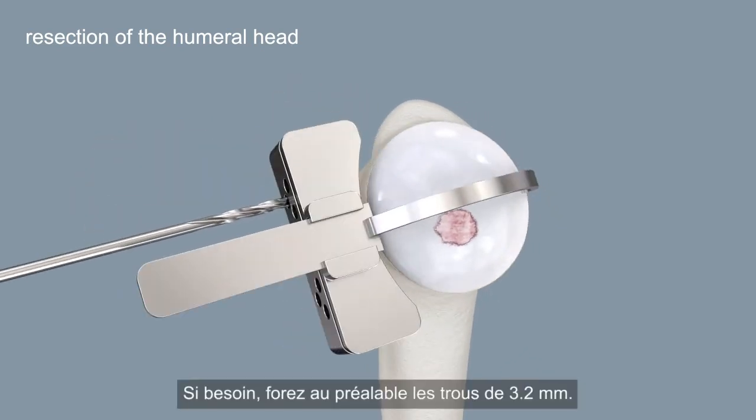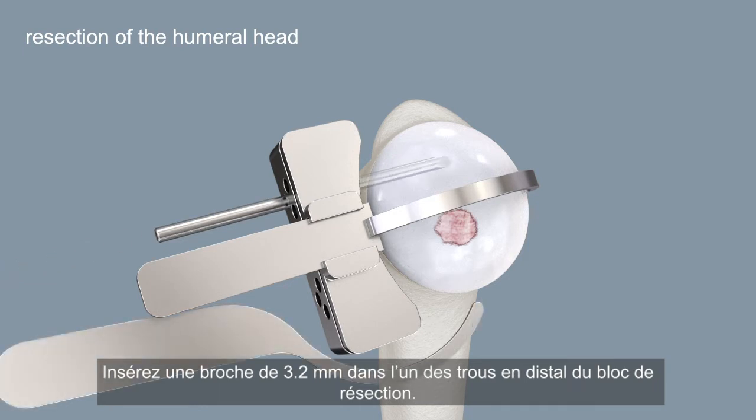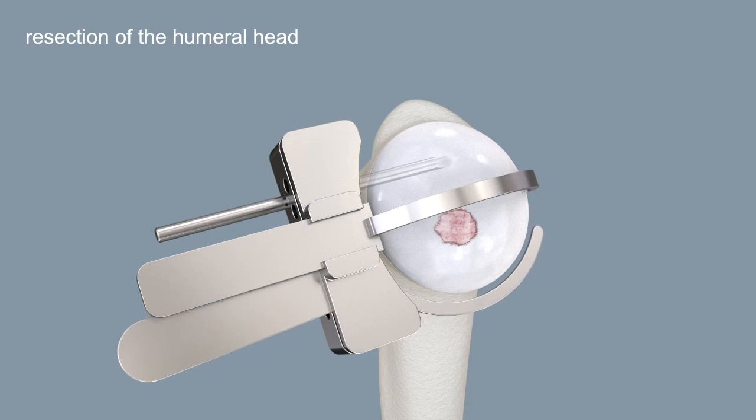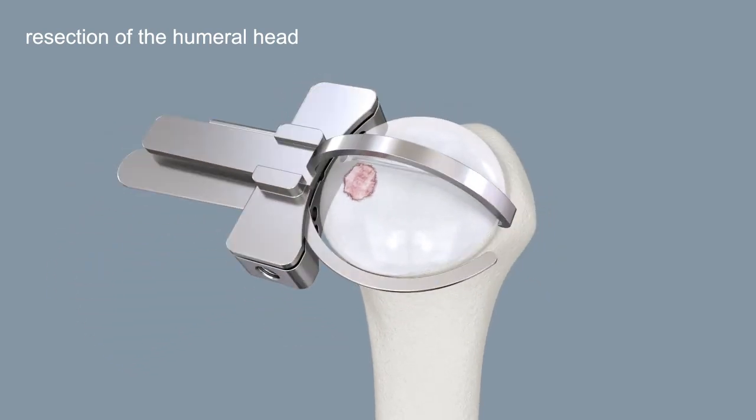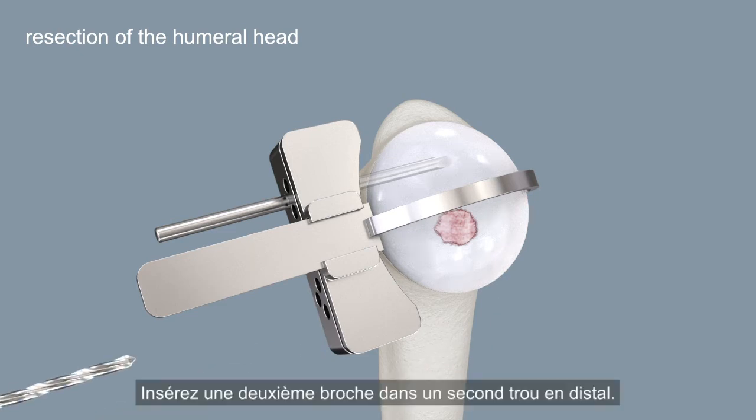Pre-drill the 3.2 millimeter pin holes as required. Insert a 3.2 millimeter pin through one of the distal holes of the cutting block. Insert a second pin into a second distal hole.